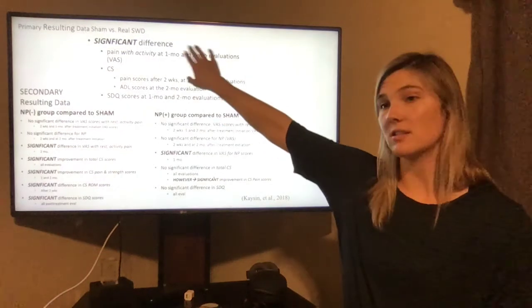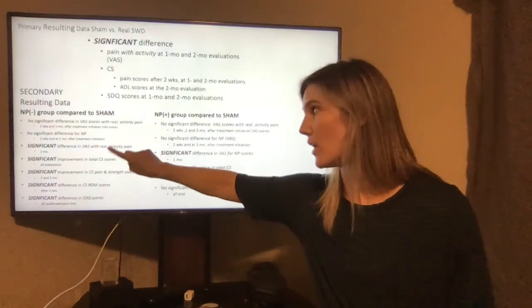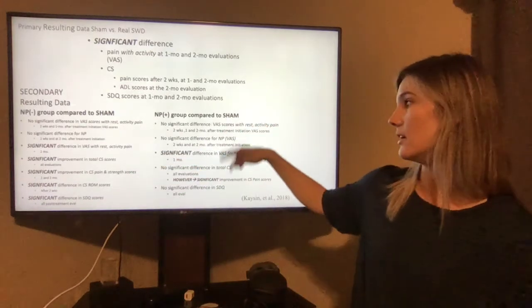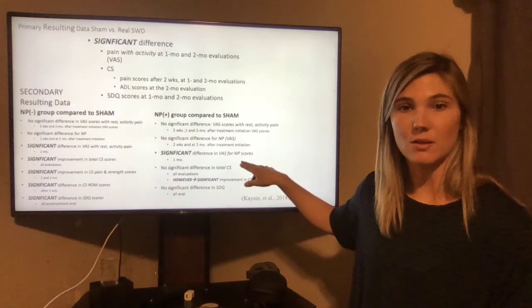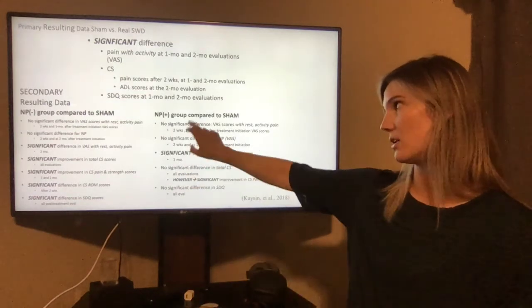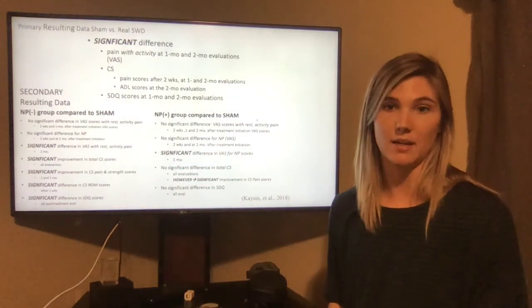So overall, they saw improvement in all, like if you put all the groups together, there was clear improvement in everything. However, the night pain negative had clear improvements in the CS, the VAS, and the SDQ. And then the significant difference was only in the VAS, so the pain scale for night pain scores, that was significant for one of the evaluations 1 month post-study for the night pain positive. So it's clear that there's a lot more improvement in the night pain negative group.